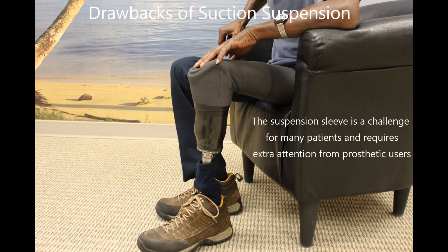The challenges of suction suspension result from the gel suspension sleeve. This sleeve can get holes in it which prevents a suction seal from occurring. The sleeve can also have adverse effects on knee flexion. Sleeves are continually improving in durability and flexibility, and using a prosthetist skilled in suction systems helps minimize a decrease in knee motion and ensures the sleeve lasts as long as possible.